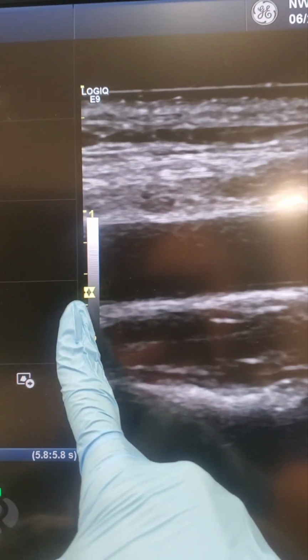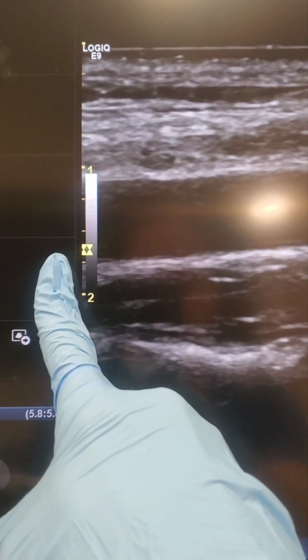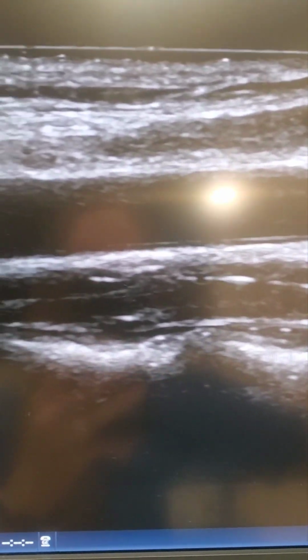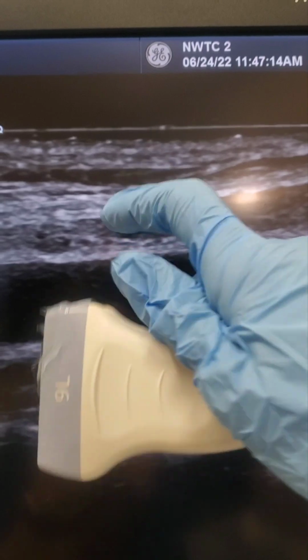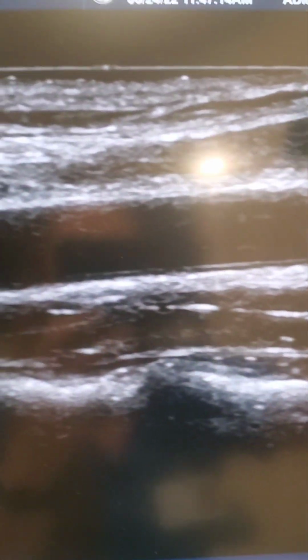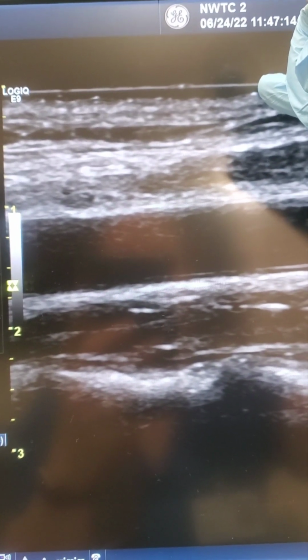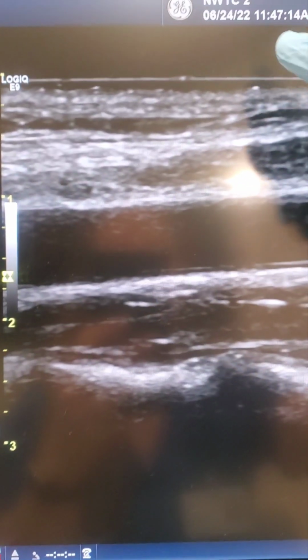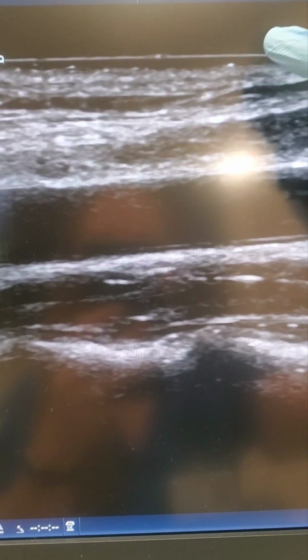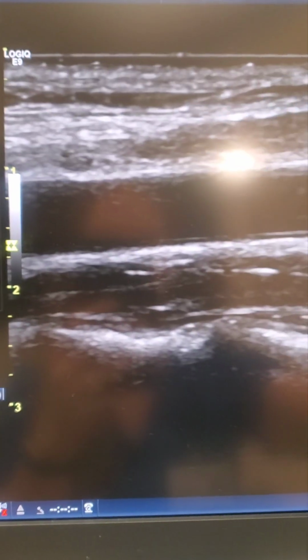this side is the patient's head. Notch side toward the patient's head. This is toward my head. This way over here is toward my feet. This side is the same side that's coming right from the face of the transducer. Okay? This is always where the base of the transducer is touching, and then away. Superficial to deep, and we're typically scanning in general from anterior to posterior of the body.